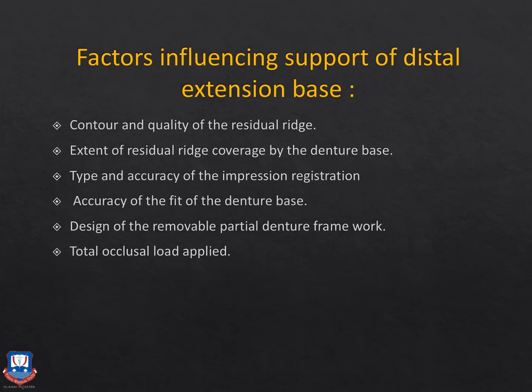Now, what are the various factors that affect the support in a distal extension base? That is in Kennedy's class 1, that is bilateral distal extension bases, and Kennedy's class 2, that is unilateral distal extension base. What are the factors that influence the support?